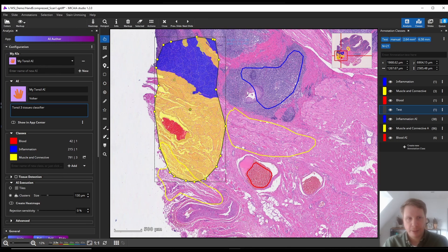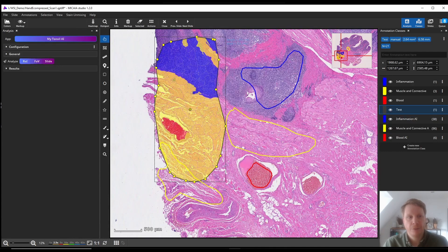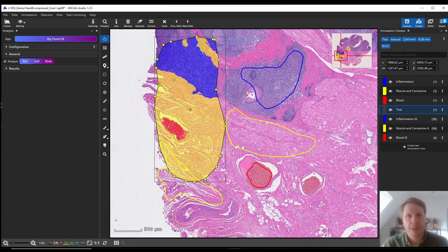By the way, the underlying technique used here is called few-shot learning, which essentially means that we are not training an AI from scratch using just these few annotations — because then we would need way more annotations. Instead, there is a pre-trained AI model working in the background that we've already trained on millions of patches from histology slides, and we've trained it in a way that it generalizes very well to new use cases or different organs. That's why it's enough to add just a very few annotations and already the accuracy will be quite good. That's the concept of few-shot learning — the AI learns using just a few shots, typically just a few annotations.